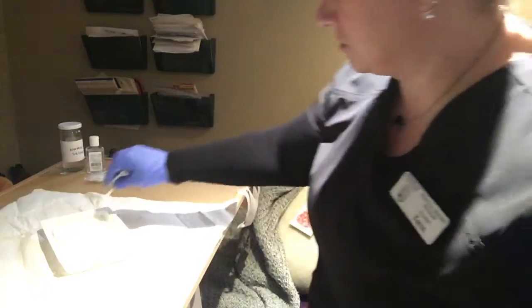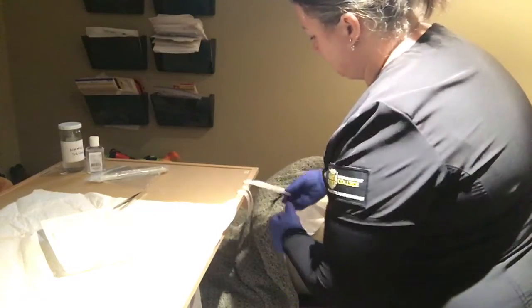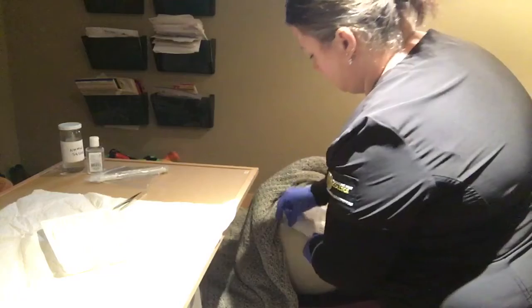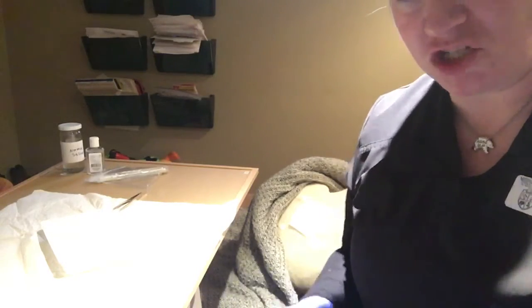Now the doctor wants me to redress the wound with the 4x4 gauze. Okay, there we go. And I'm going to tape it. And after we're done dressing it, we always want to put our initials and the date. This lets the next nurse on duty, or whoever the next nurse is going to be later on in that shift, know when that dressing was last changed.